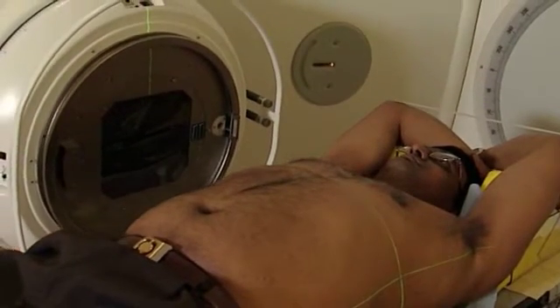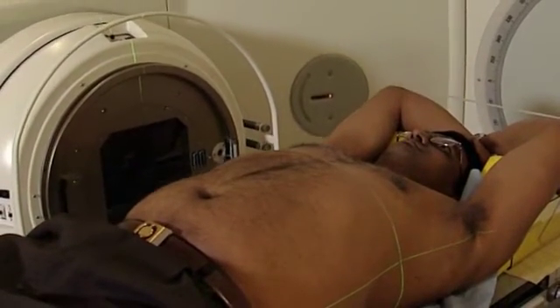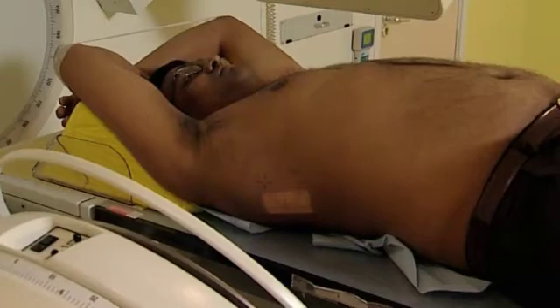At commissioning we have to check the integrity of the mechanical components, because it is indeed a mechanical machine with a lot of heavy equipment involved. There is also a lot of electronics involved and they can drift, which can severely affect the beam. And of course, if the beam isn't right — because we can't see radiation — we might be severely damaging the patient.